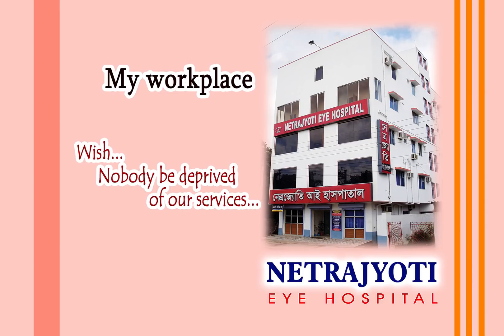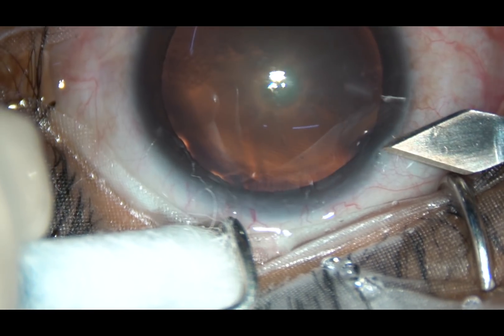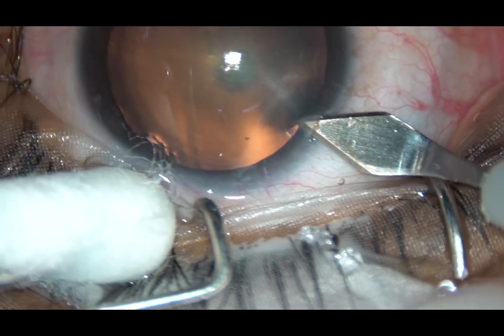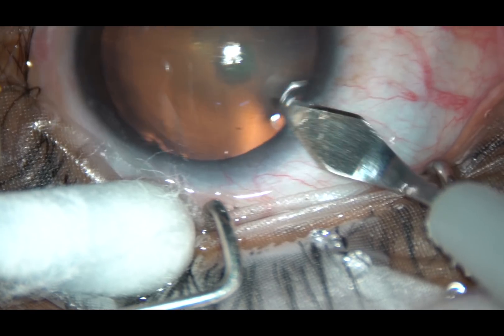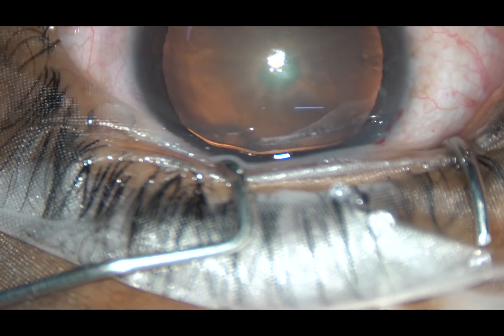Dear colleagues, in this video I want to show the carousel technique of soft nucleus management in phaco surgery. This is a posterior subcapsular cataract with a very soft nucleus. This is the main incision — a 2.8 mm incision.